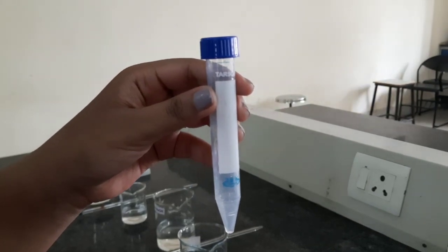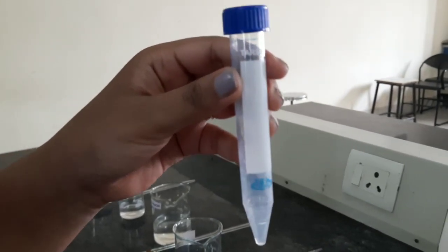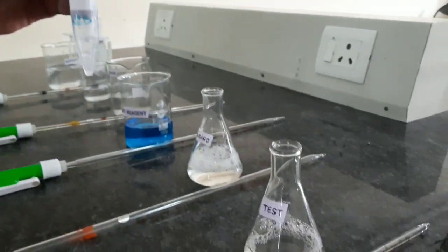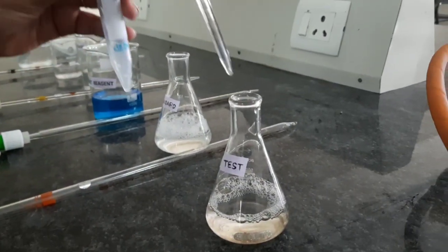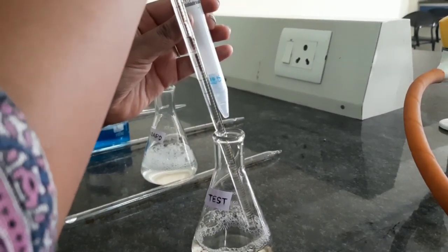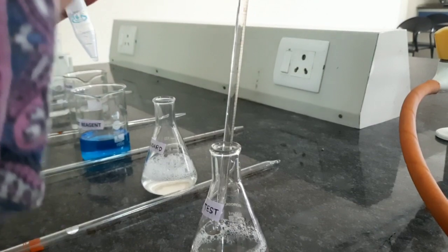We are going to take a centrifuge tube in which we will take 1 ml of urine sample. So the test is our urine sample. We are going to take 1 ml of urine sample.